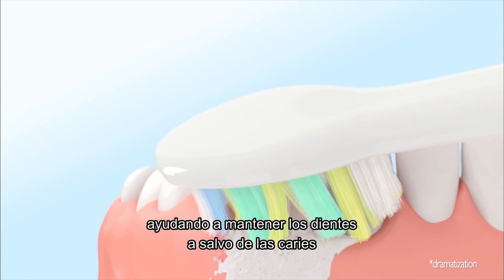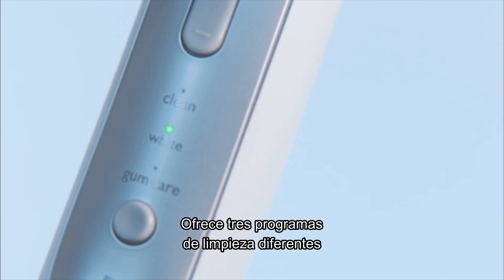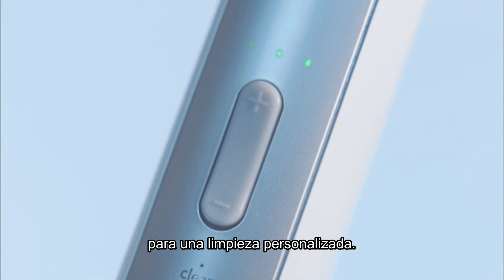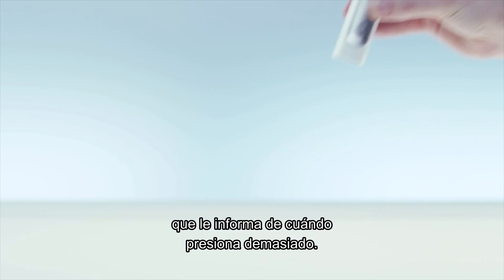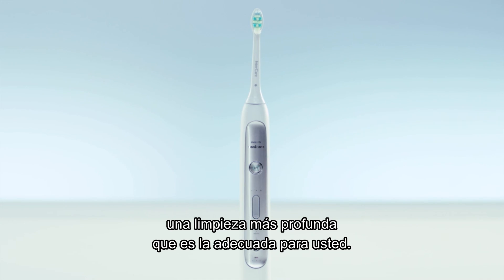Helping keep your teeth safe from cavities while improving gum health in just two weeks. It comes with three different cleaning modes and adjustable intensity levels for a personalized clean, and a unique pressure sensor that lets you know when you're brushing too hard, which means you can always give your teeth a deeper clean that's just right for you.